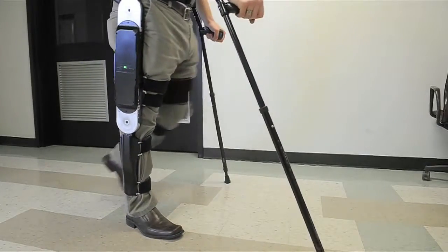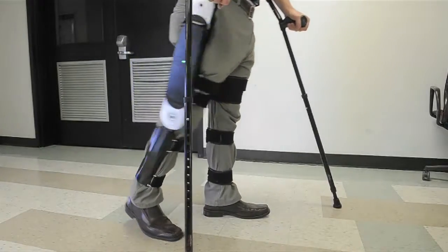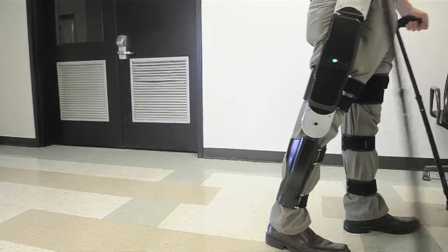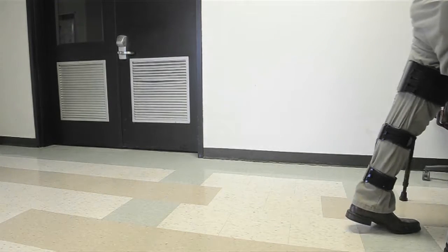You'd be surprised at the difference of interacting with somebody at eye level versus always having to look up at them. It really kind of changes something. And there's also just something innate and human about upright locomotion.